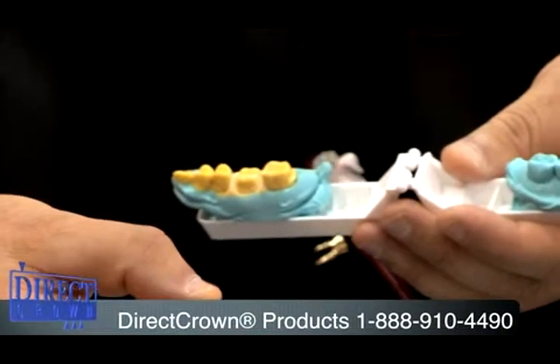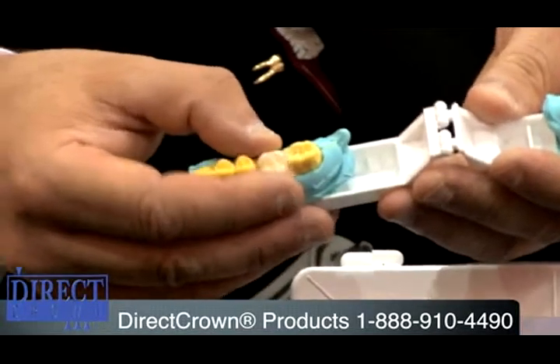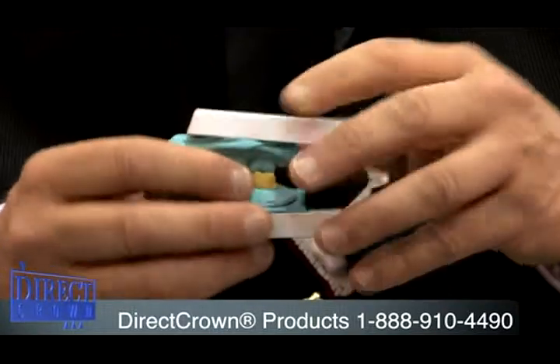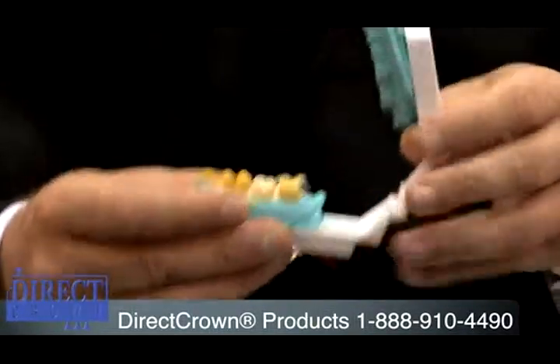Now, in the mouth, and we'll just consider that this is a human jaw here. Once the tooth is prepared, choose the appropriate crown shell that would fit over the top of the tooth. Once that crown shell is fit, we verify that the patient can close down into it and it has clearance, it's not impinging on the tissues. And then we'll go ahead and activate the internal surface. Generally, sandblasting the internal surfaces will give us better retention, and then painting it with some bond.